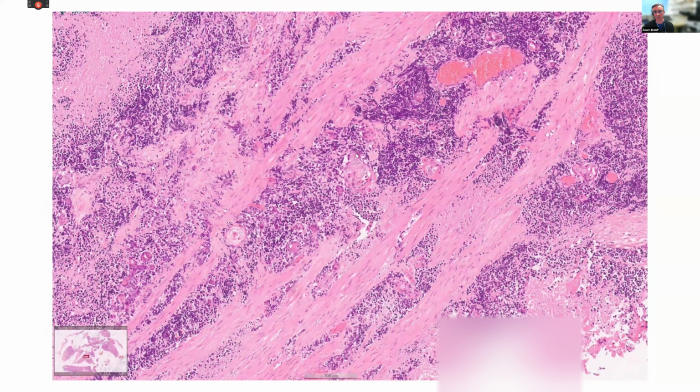And again, from the comments and looking through the tumor, there were areas of squamous differentiation as well, nestled in amongst the neuroendocrine bits. So got lots of necrosis at the top left here, sheets of infiltrative neuroendocrine, and then small squamous looking areas. And then also, perhaps not the best picture, but there were areas of muscle, detrusor muscle in this, and it did look as if the neuroendocrine carcinoma was infiltrating through the muscularis propria.